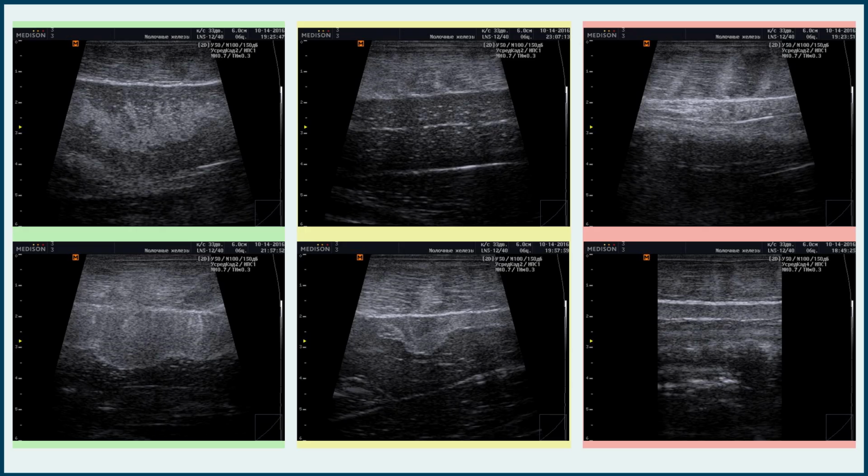And to conclude, what else can help you assess whether you are diagnosing correctly or something is wrong? On this slide we collected sonograms made by our student during the diagnostics of the breeding group of Russian and Siberian sturgeon hybrid. All examined fish were of the same age and approximately the same weight of 3 to 4 kilograms. It is clear that in a group of fish of the same age kept in aquaculture conditions, despite individual variability, a cardinal variation of sexually mature stages is unlikely.